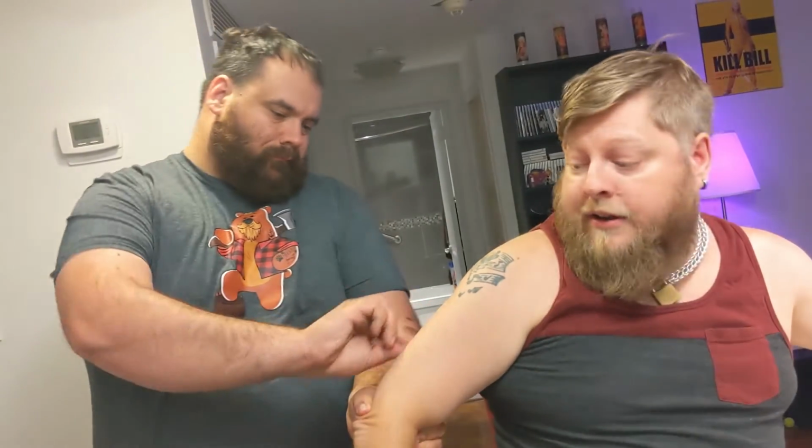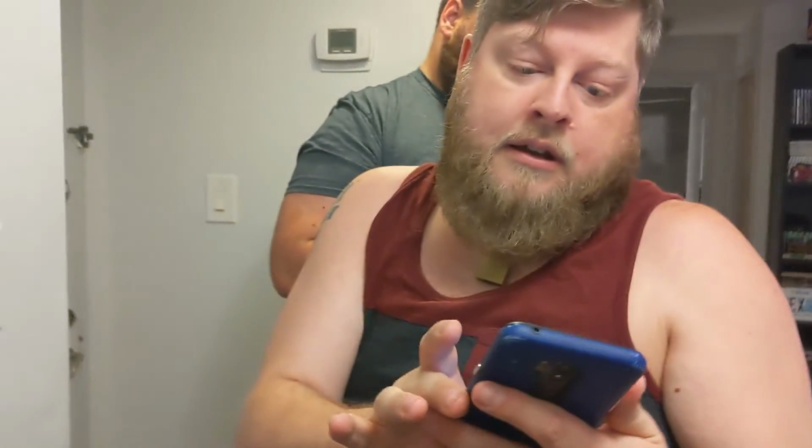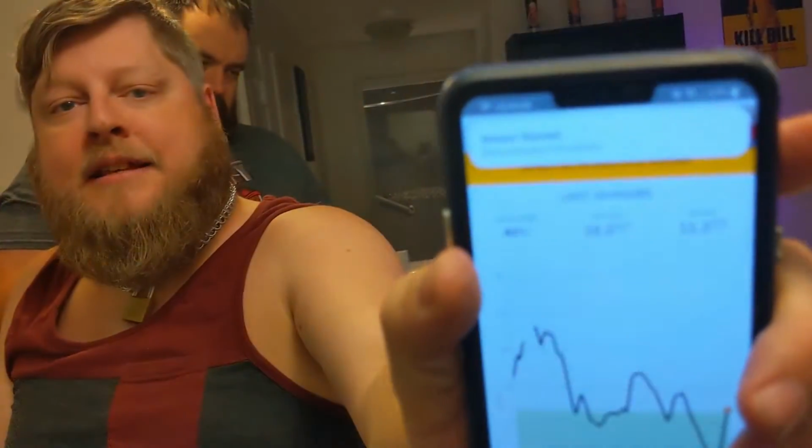So what I do is I now go back to my app and I will scan the new sensor. It will give me a message stating that there is a new sensor found. And I gotta scan it again. Now I've got a message stating it'll take 60 minutes. So the sensor takes 60 minutes to get used to your body, and then I should start getting readings within an hour. Yay! Just like that.